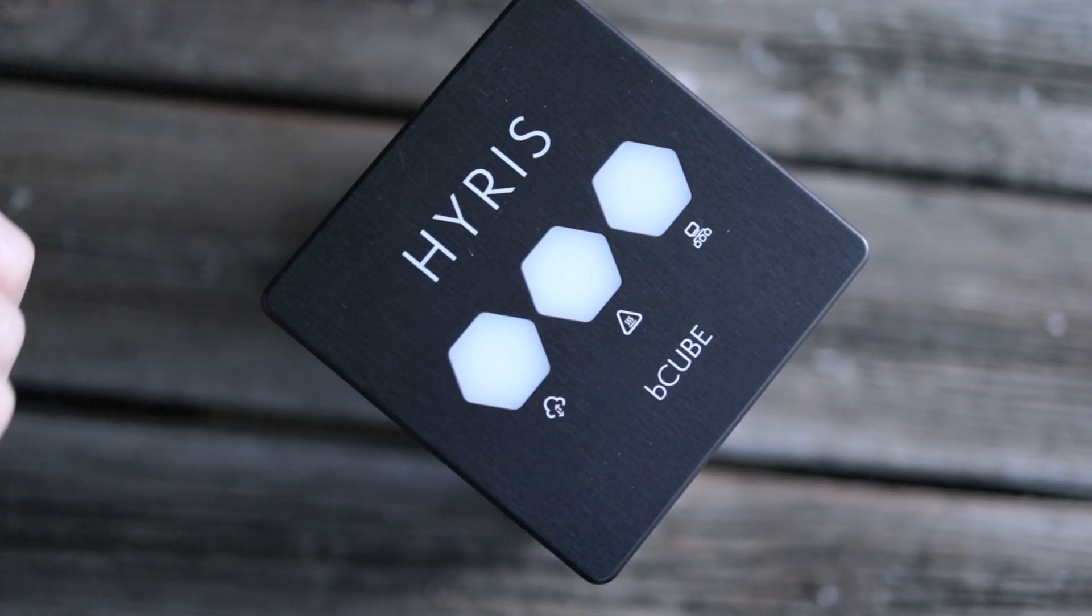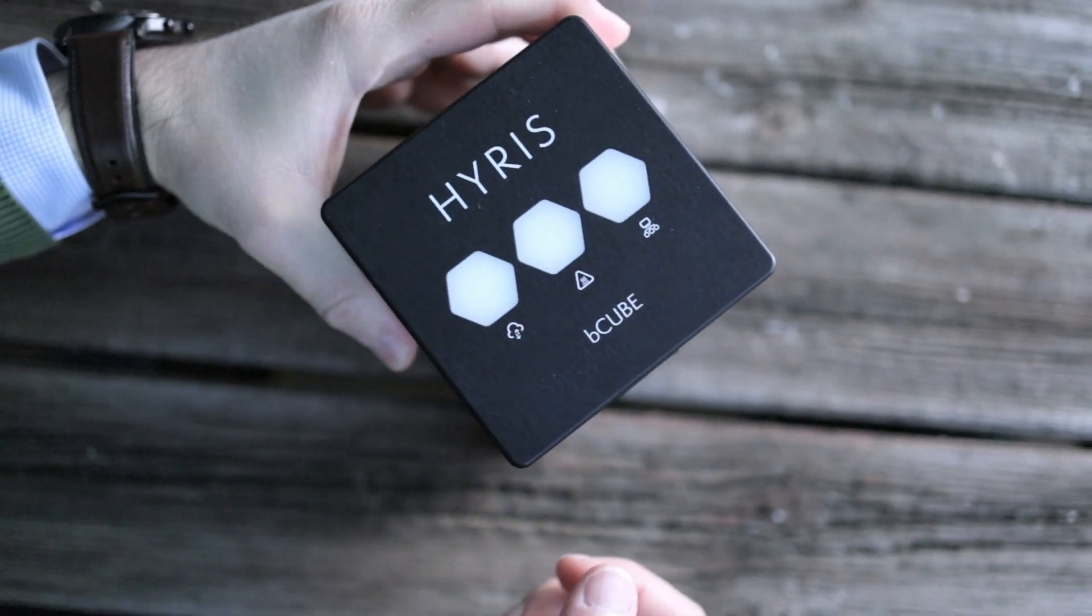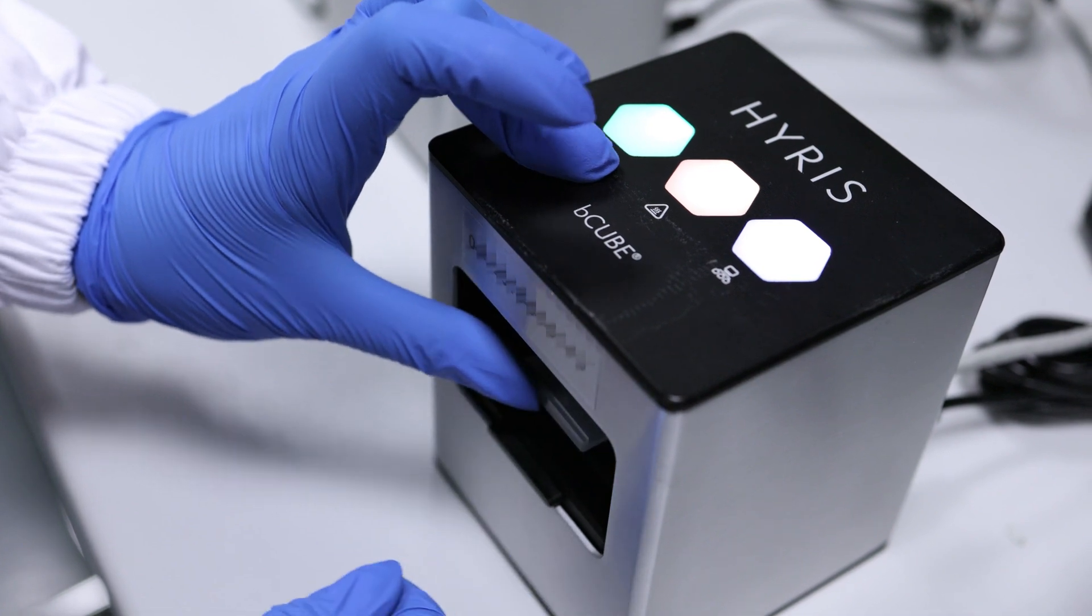The heart of the system is the HiRIS B-Cube, a miniaturized diagnostic device weighing less than one kilogram, which sits in the palm of one hand.